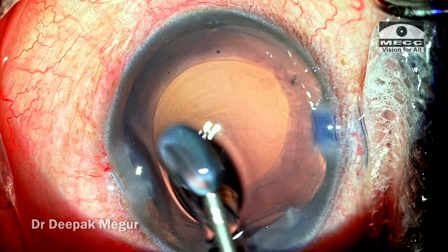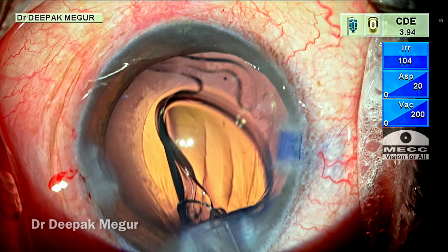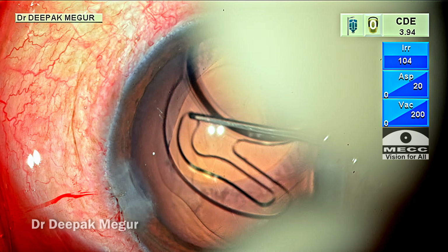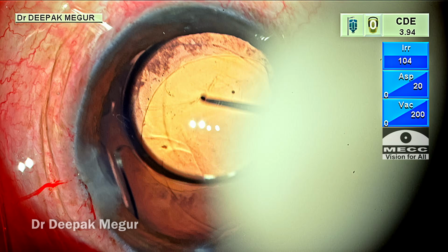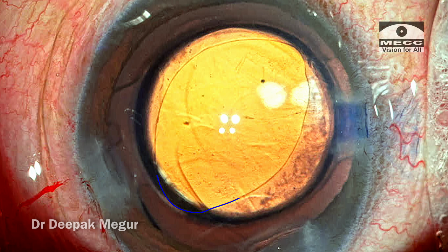OVD is placed into the capsular bag. The planned single-piece hydrophilic lens, which is the Rayner one in this case, is being implanted into the capsular bag. And the moment the lens goes in, I can suddenly see that the circular rhexis has now become oval.